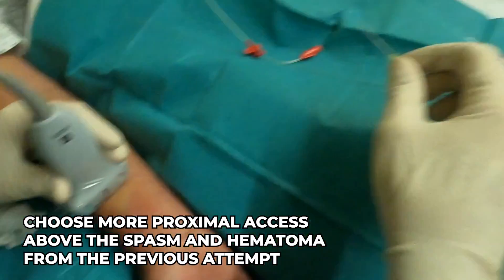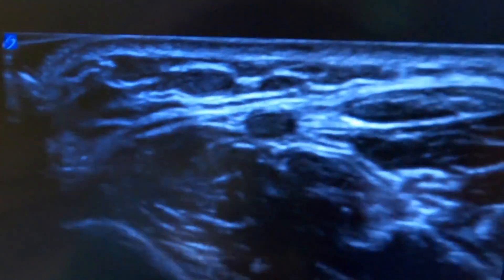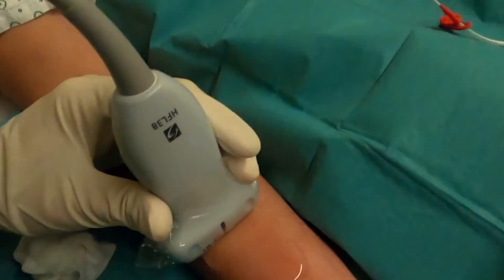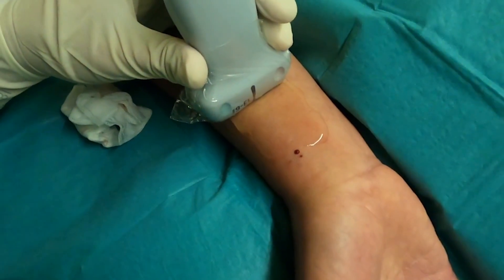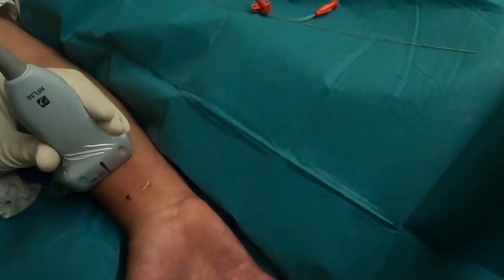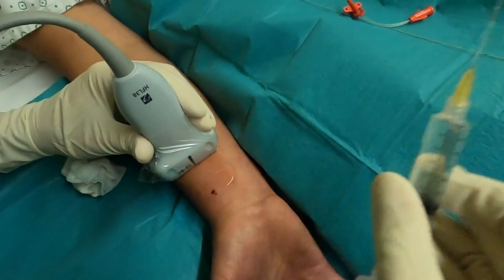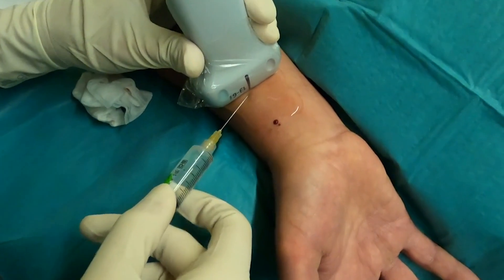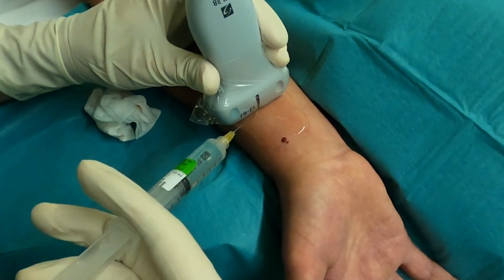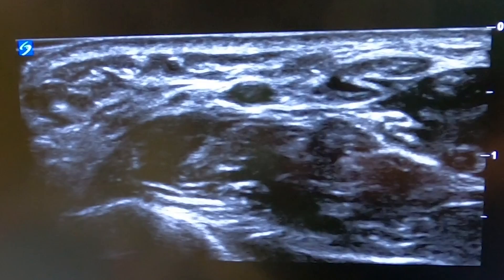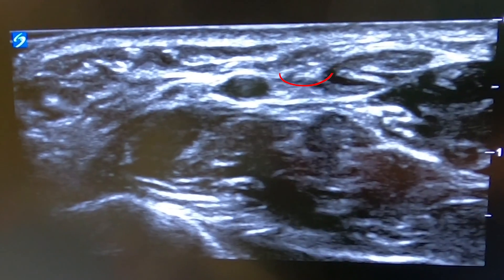More proximal — and there's the artery. Now we're back to the normal lumen, away from the site where it's in spasm. We can give some more local anesthetic on both sides. This is exactly what we want — this prevents arterial spasm.